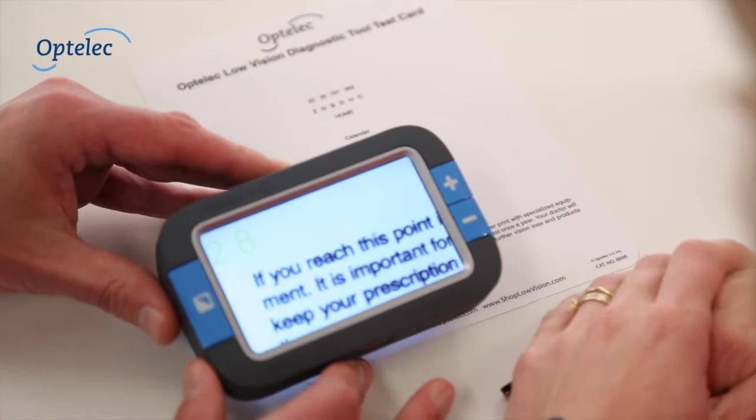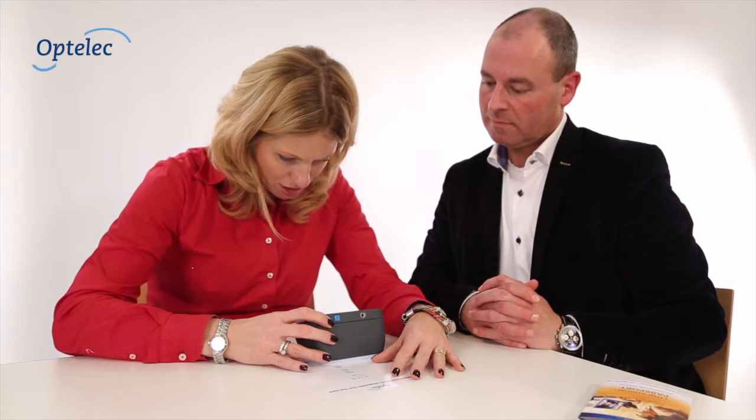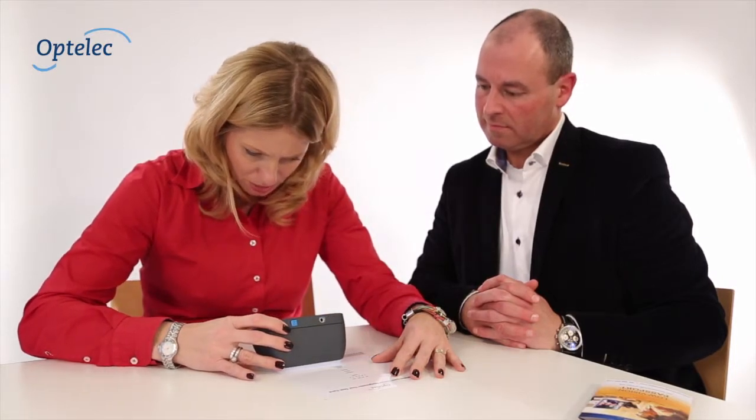To assess the patient's reading ability and determine whether electronic vision aids can potentially help, place the diagnostic tool over the sentence at the bottom of the test card. Ask your patient to read the sentence and indicate if the reading speed is fluid, slow, or very slow. Adjust the settings to find what is most comfortable.